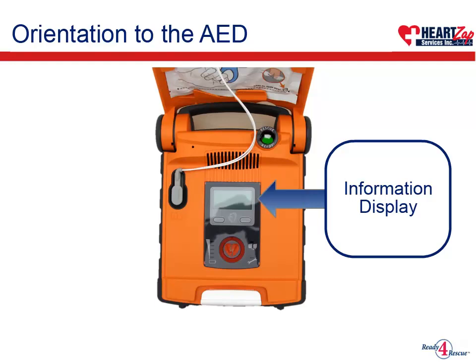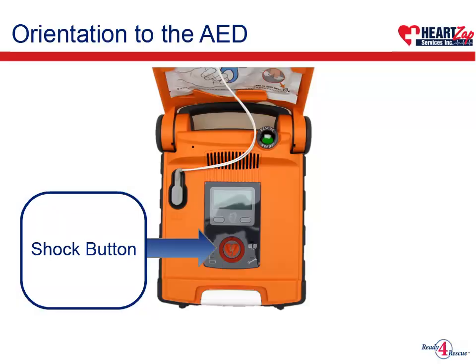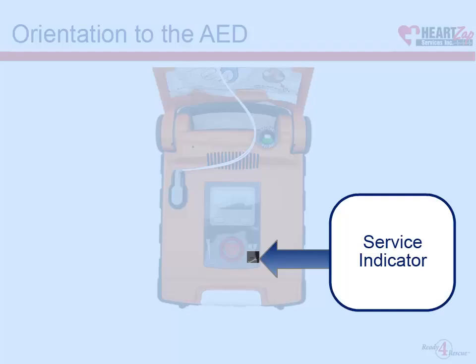Number of shocks delivered and rescue time is also displayed. Shock button. This will light red when the AED is ready to deliver a defibrillation shock. Rescuer is to press the red light to deliver therapy to the patient.